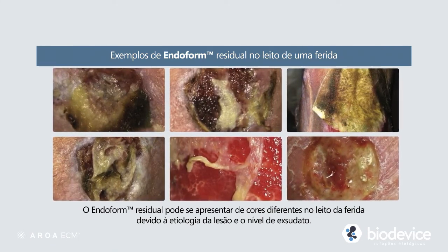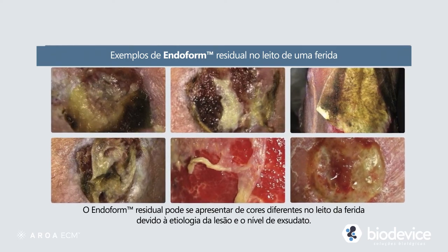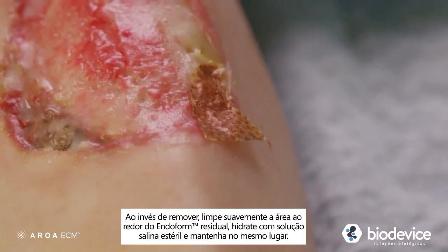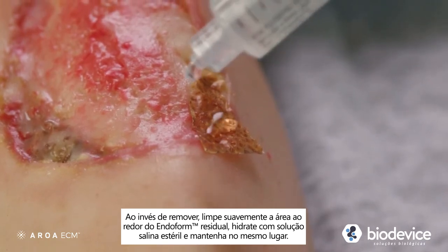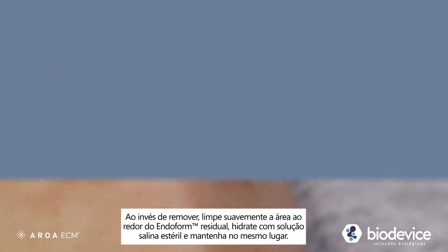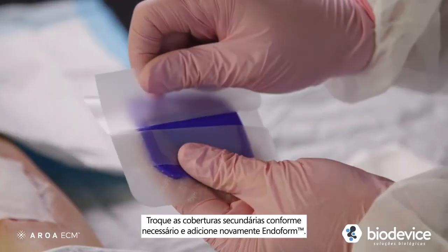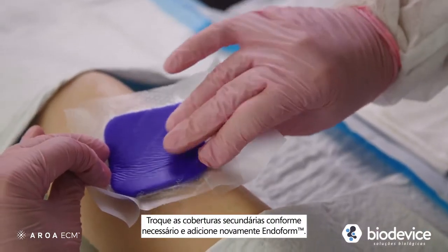Residual Endoform can appear as different colors in the wound bed, due to the type and level of exudate. Instead of removing, clean gently around the residual Endoform, rehydrate with sterile saline, and leave in place. If Endoform has overlapped onto the area surrounding the wound, the loose portion can be gently removed if desired. Change secondary dressings as needed and when reapplying Endoform.